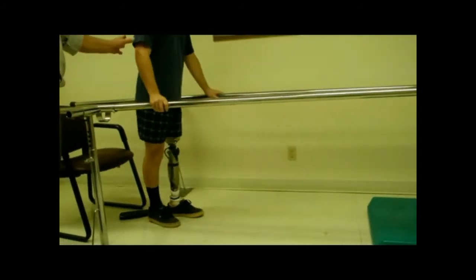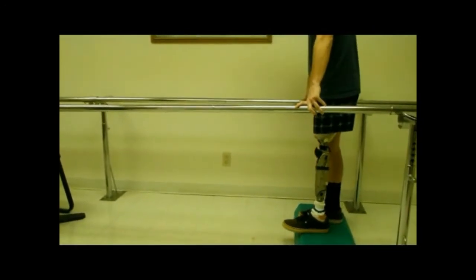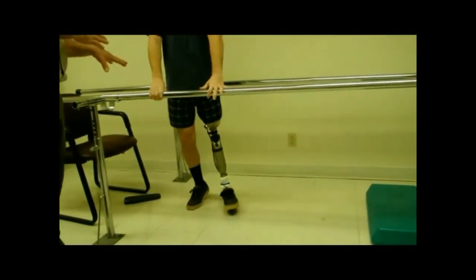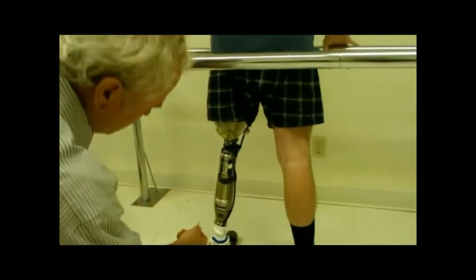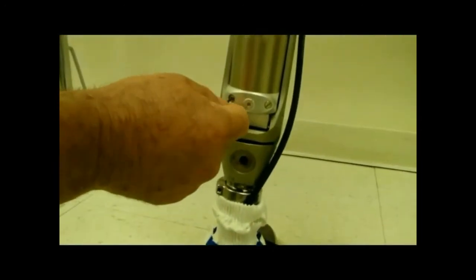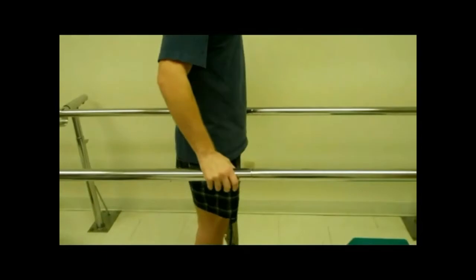All right, before I make an adjustment, let's go ahead and try the step again. There we go. Did you hear the shoe is still catching? It's a little bit too much resistance for him, so I'm going to turn it down just a hair. So I'm always finding, first, the most important part is security. You want to make sure they feel secure. And I just moved it a hair. All right, let's try it again. Go backwards first.